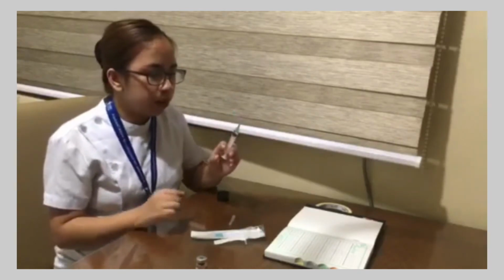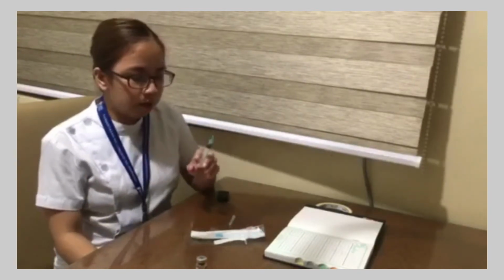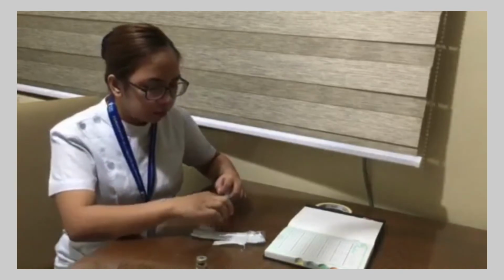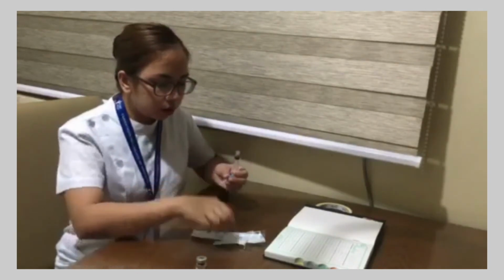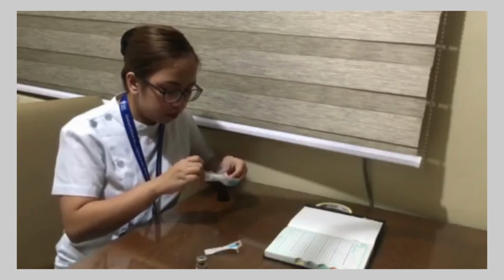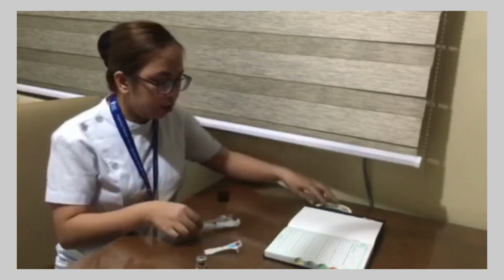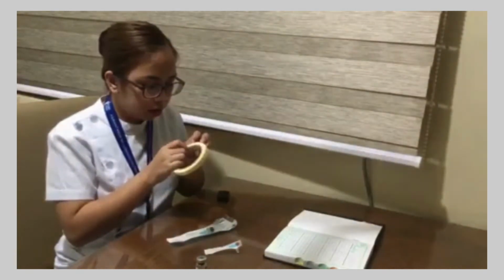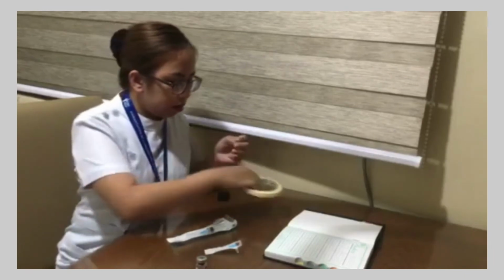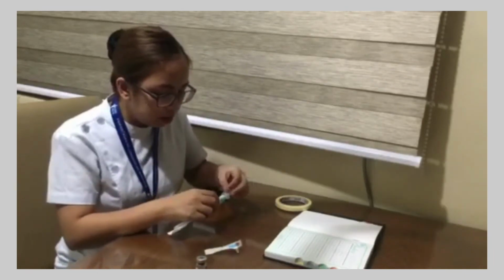I'm going to replace the needle cap using the scoop method. This is to maintain the sterility. After that, I'm going to remove the filter needle and use the regular needle again. Also, put a label marking the type of medication and that you are going to use it on this patient.